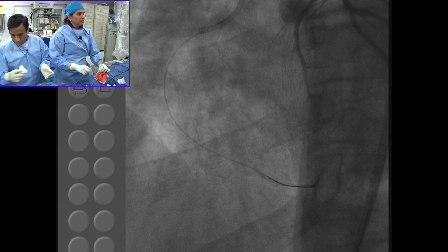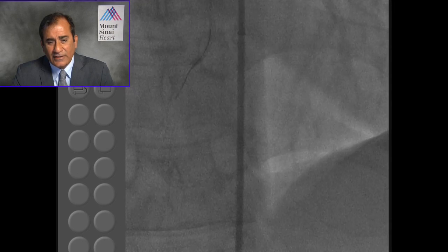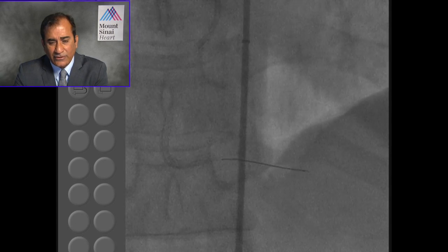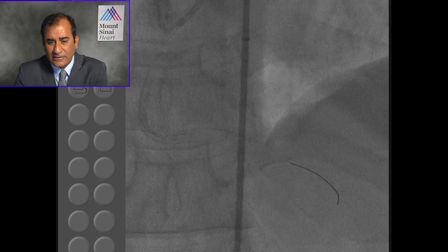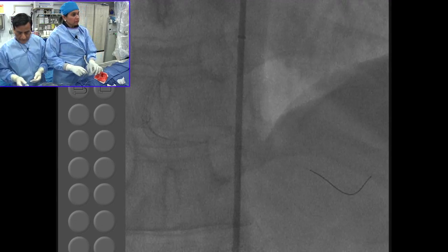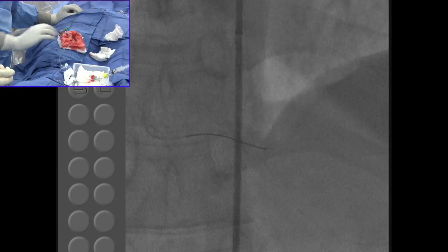Yeah. So, Sameen, how do you balance this now? I kind of got a gist of your thoughts on this, that go antegrade, another antegrade before you go retrograde. But some of the data from the complication rates from the retrograde does bring some concerns to this thought, no? Yes, absolutely. Go with the safer strategy and give it a second shot.